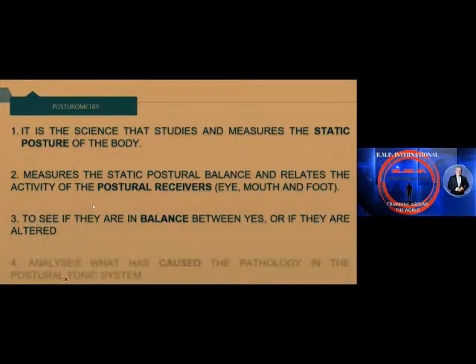We measure to see if they are in balance between them, or if they are altered. And if they are altered, we can measure what they are causing to the tonic postural system.